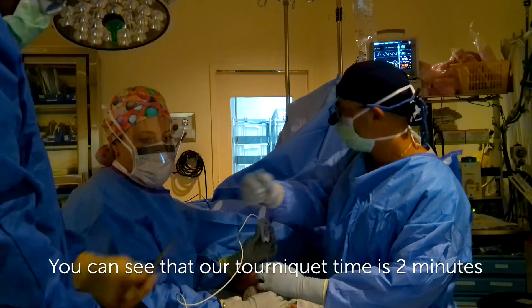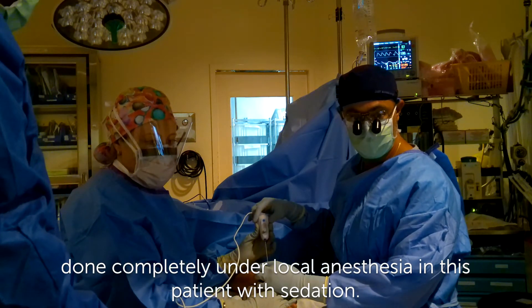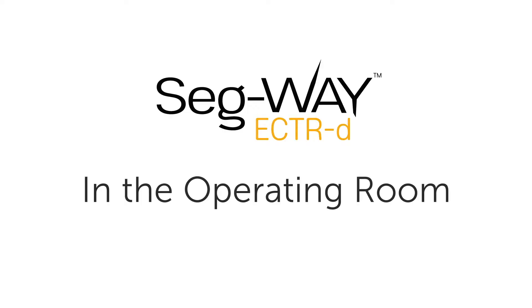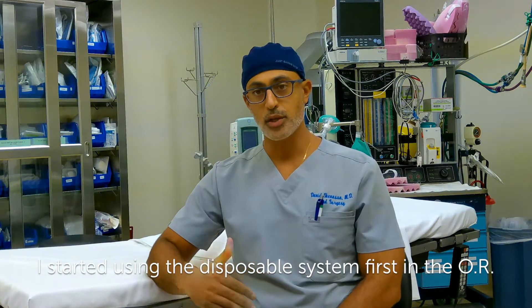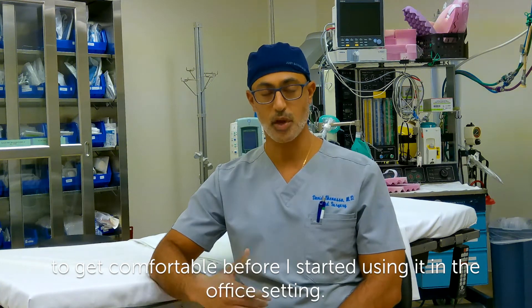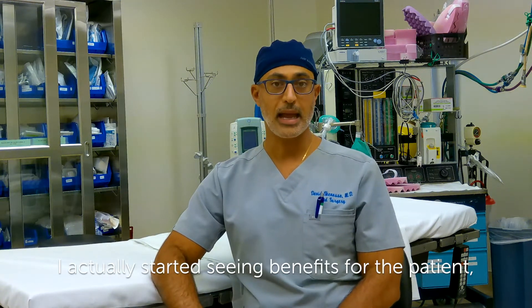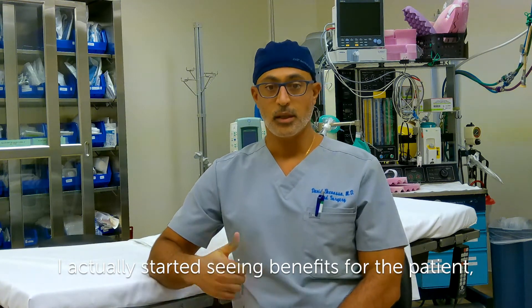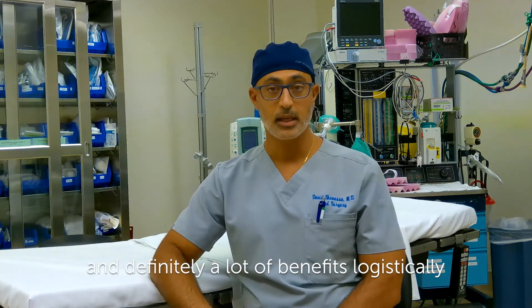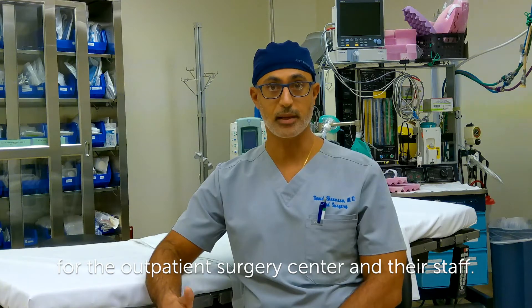You can see that our tourniquet time is two minutes, done completely under local anesthesia in this patient with sedation. I started using the disposable system first in the OR to get comfortable before I started using it in the office setting. And once I started using it in the OR, I actually started seeing benefits for the patient, benefits for my staff, and definitely a lot of benefits logistically for the outpatient surgery center and their staff.